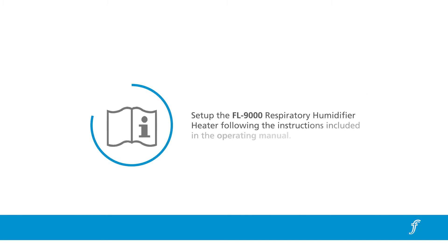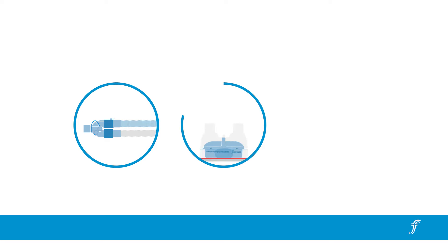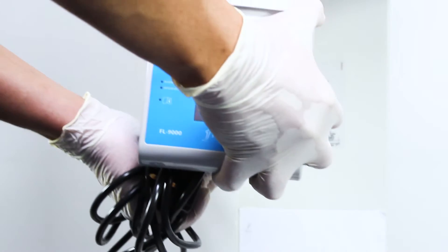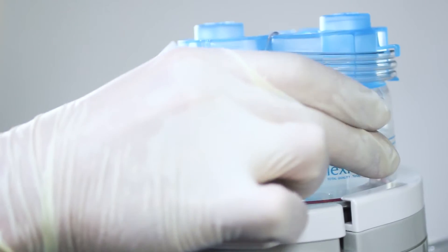Set up the FL9000 respiratory humidifier heater following the instructions included in the operating manual. The use of breathing circuits, humidification chambers and other accessories which are not approved by FlexiCare may result in sub-optimal performance and may place the patient at risk. Fit the humidification chamber to the heater plate by applying downward pressure on the spring-loaded front guard and sliding the chamber into position.